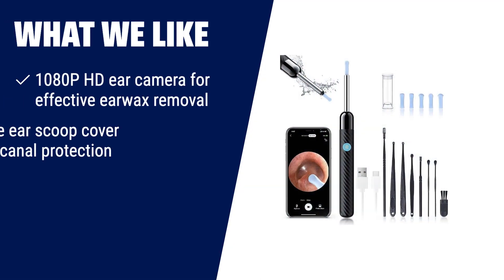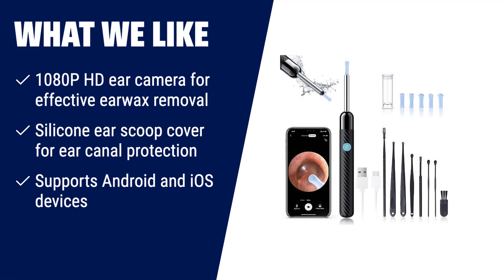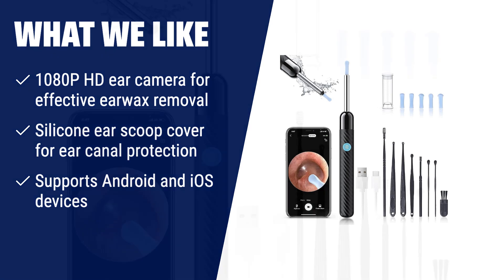What we like: Want to see and clean your earwax effectively? The earwax removal kit with camera is here to help. With its 1080p HD camera and 6 LED lights, you'll have a clear view of your ear canal. The silicone ear scoop cover ensures gentle and safe cleaning. Plus, it supports both Android and iOS devices, making it convenient for everyone. Take control of your ear hygiene with this advanced ear cleaner.